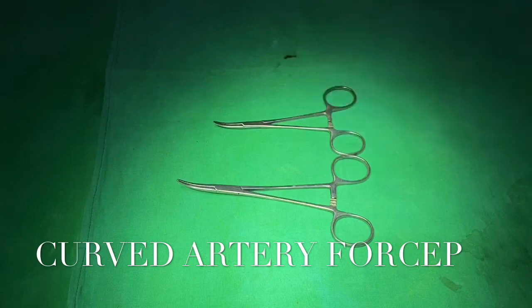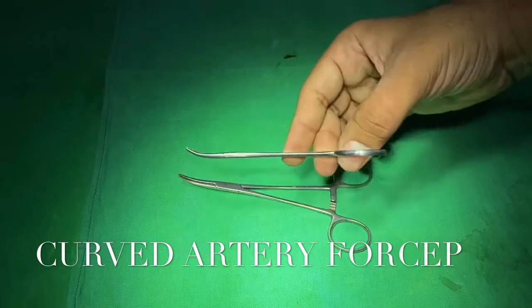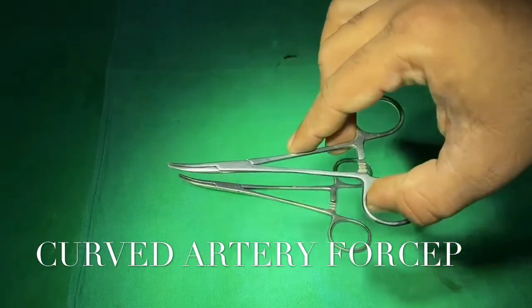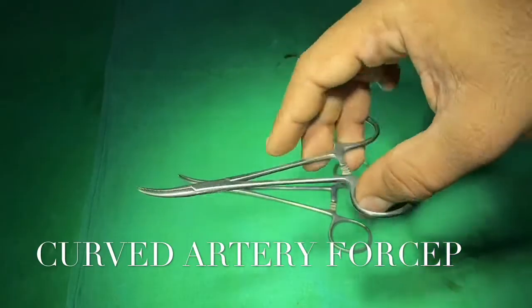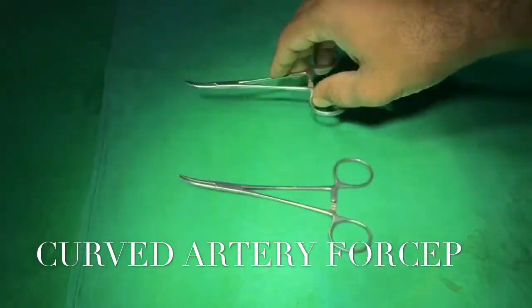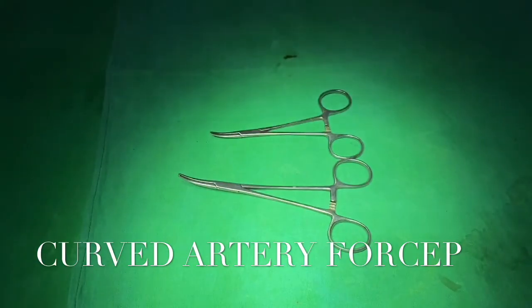This instrument is nothing but curved artery forceps, but in a smaller size of approximately four inches. This instrument is called mosquito forceps — it is simply a curved artery forceps but smaller in size.